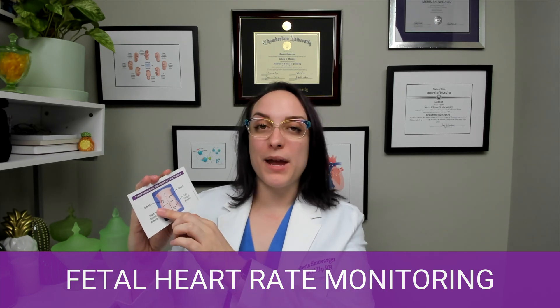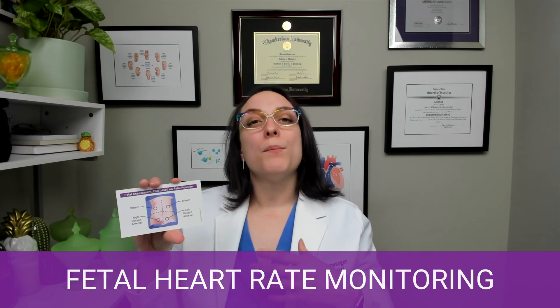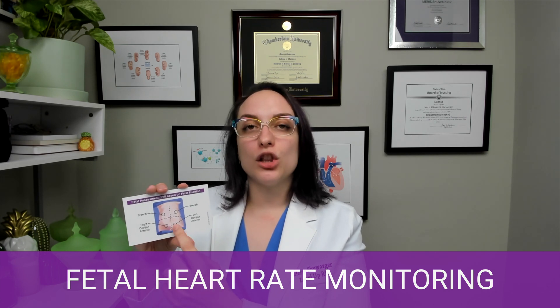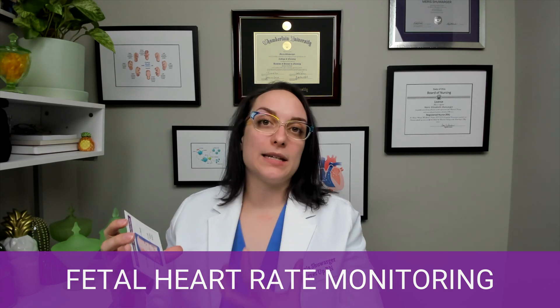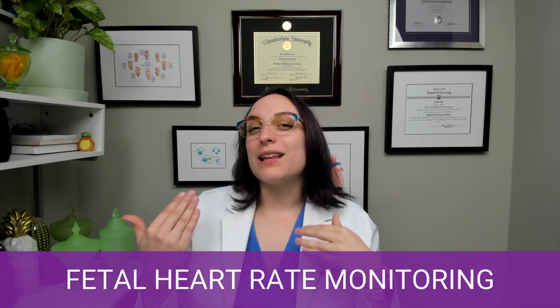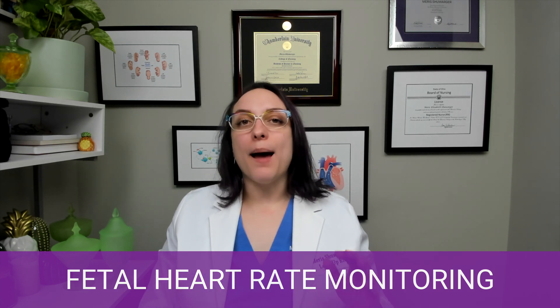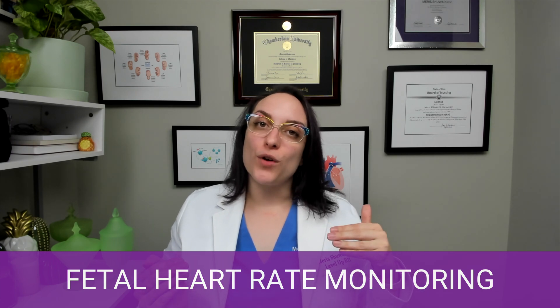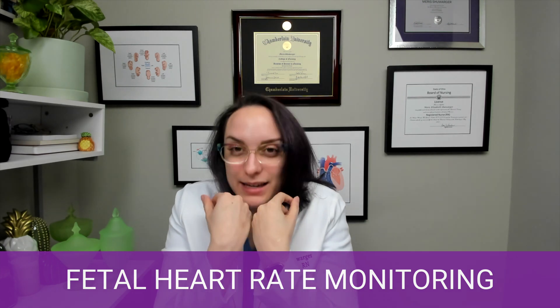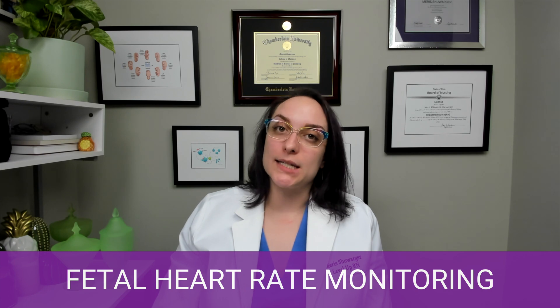The place where I put the heart rate transducer changes based on baby's positioning. We have an illustration showing this: if baby is breech, we'll be in the upper quadrants; if baby is cephalic or vertex — head down — I'll use the lower quadrant to identify the fetal heart rate. And it's a little counterintuitive, but I'm listening through the baby's back, because when they're all tucked in tight, it's hard to get a good reading. So along the fetal back is where we place that transducer.